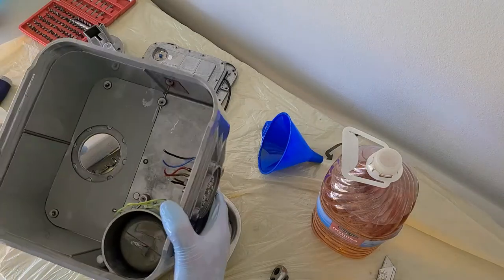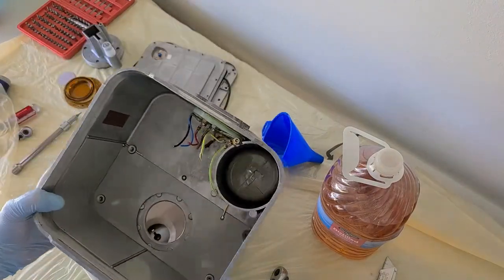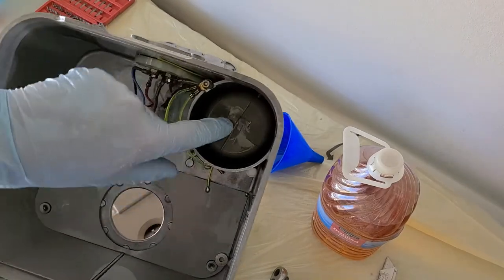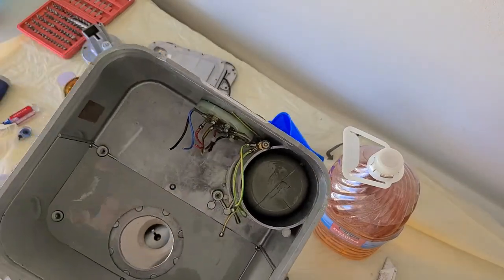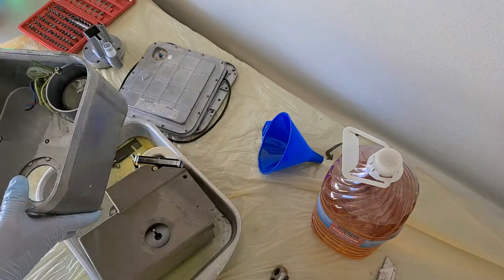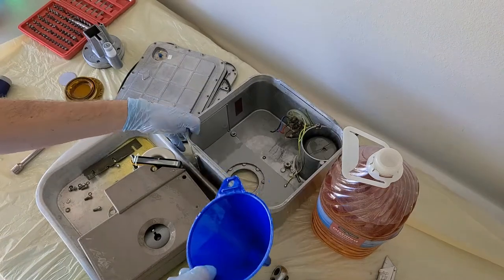All right, so the housing is free. Here's the little expansion tube that I poked the holes in, and all the cable connections to the tube right here. I'm just going to put this aside. It's going to go in the trash.